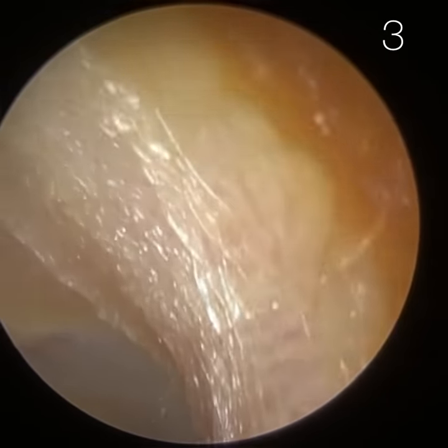This is the same patient — their left ear. There's a bit of skin here, so we're just going to give it a quick clean up, just any large bits. If the eustachian tube fails to open, it could be because the patient has anatomically a very narrow eustachian tube, the muscles have become weakened and can't contract, there may be a physical obstruction such as a nasal polyp or deviated septum, or there's an infection such as rhinitis or sinusitis, or allergies causing congestion or mucus.